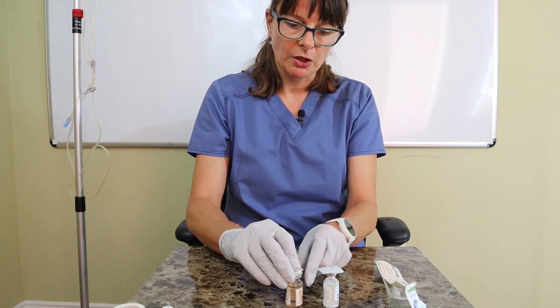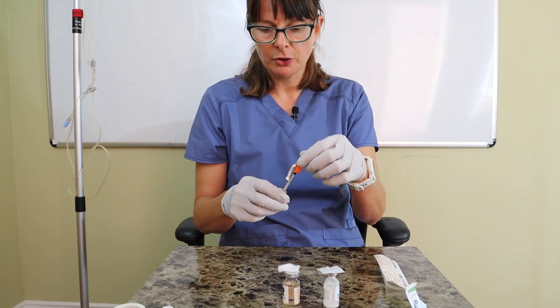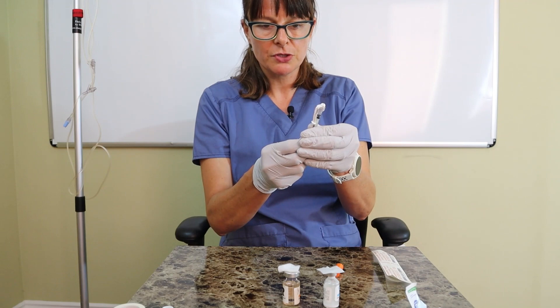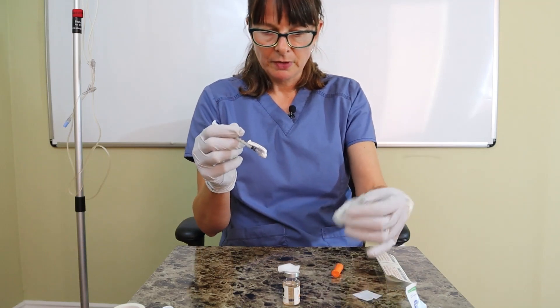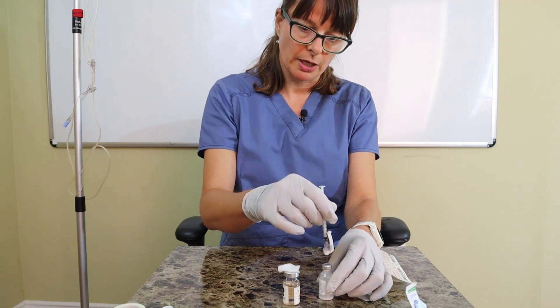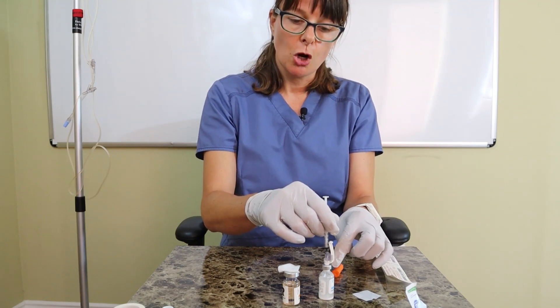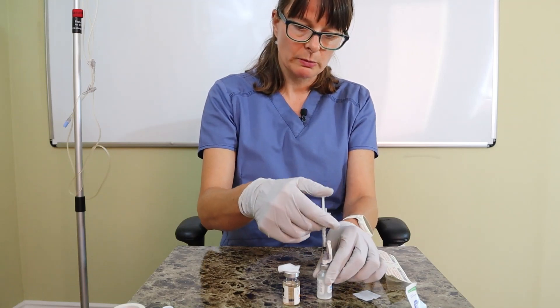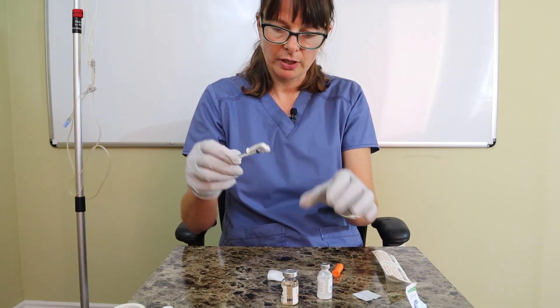We said 10 units of NPH and 5 units of regular, making a total of 15 units. Because I need to insert air first, I'm going to draw up 10 units of air to insert into the NPH vial. I do not want to turn the vial upside down at this point, because I could get liquid onto the needle and carry it over to the other vial. So I insert the 10 units of air into NPH and then 5 units of air into the regular vial.